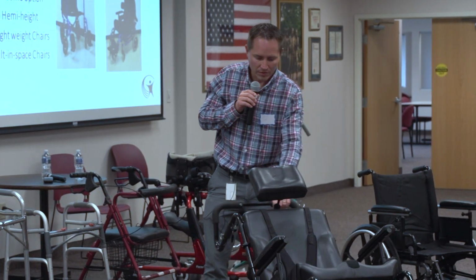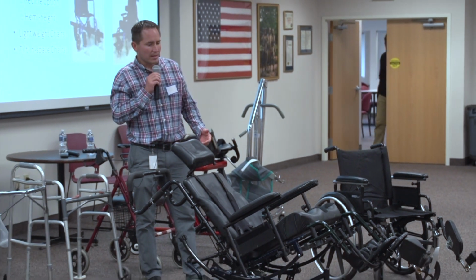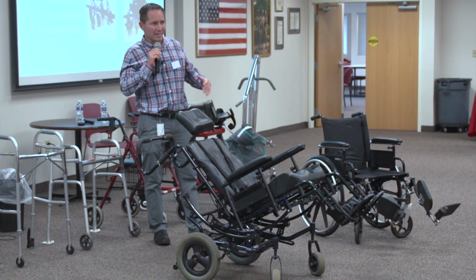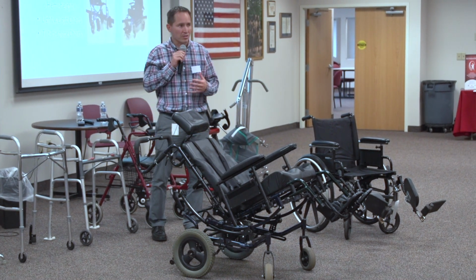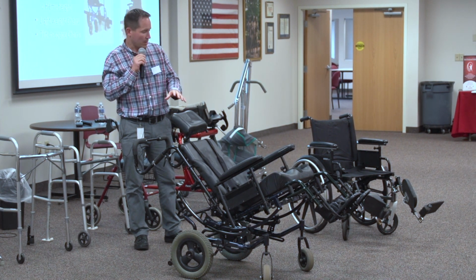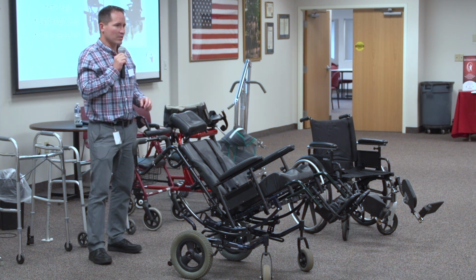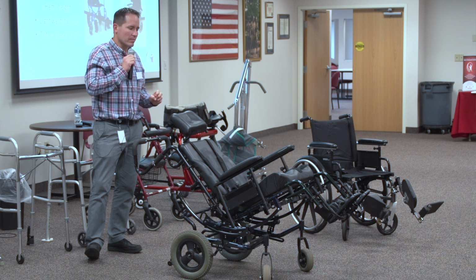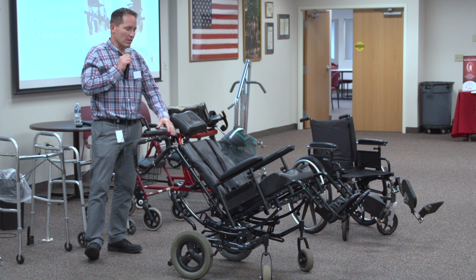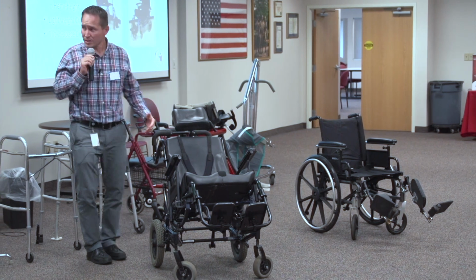These are definitely more involved. These are for those individuals that need repositioning. They can't change their position in the chair, so we can tilt this and it can change the pressure to their bottom and their back. We do a lot of these chairs. Again, these are covered by insurance. It's getting more difficult for Medicare coverage on some wheelchairs; the lightweight standard chairs are hard to get covered. These, though, aren't so much, as long as you can justify a need. So those are your types of manual chairs.